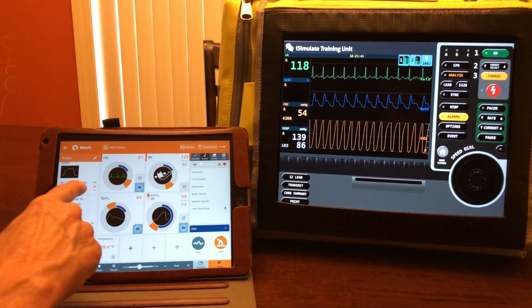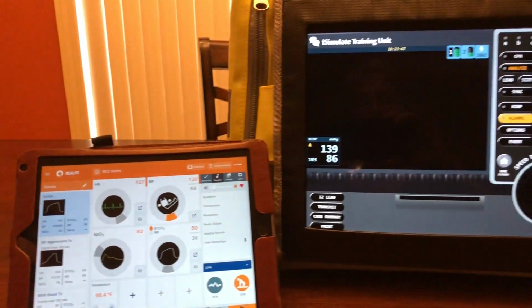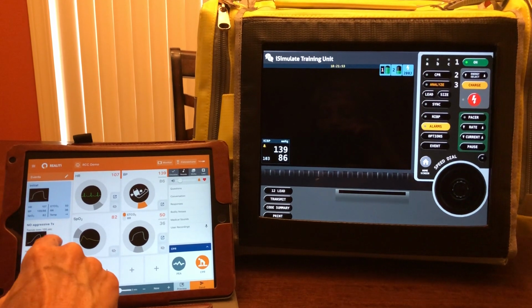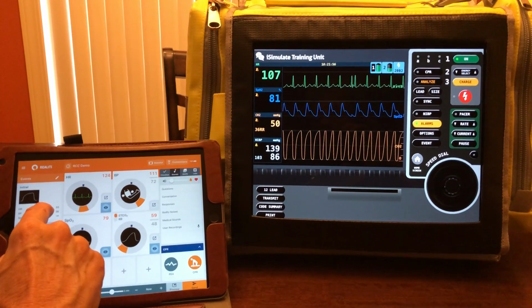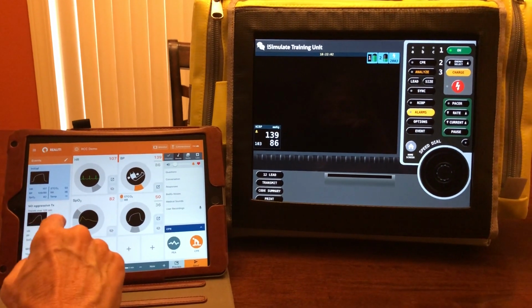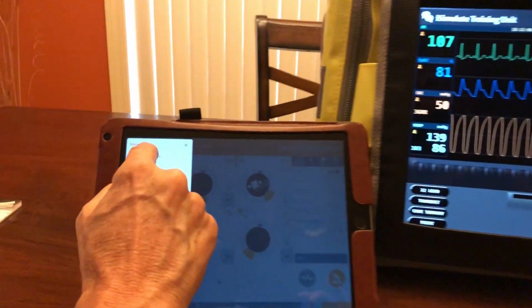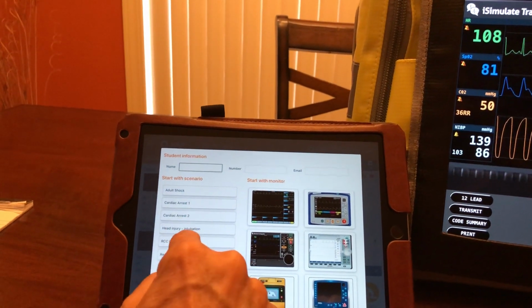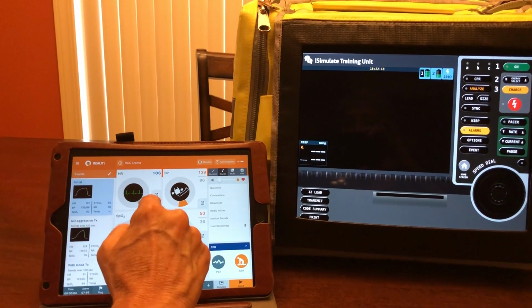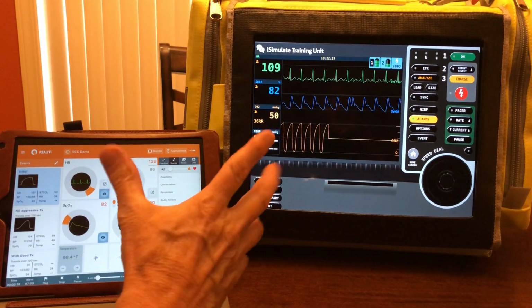The other thing that you can do is you're running this, and I'll go back to the original scenario here right now, and we're going to start, and we just lost connection for some reason. I'm not sure why it doesn't like the initial connection here. So let me instead, we're going to go to our menu, and I'm going to restart this scenario. And it says, are you sure? And I'm going to say, yes, I am sure. And I'm going to start the scenario. So now we're going to have our patient who's hooked up that we just talked about. And your patient is doing this.